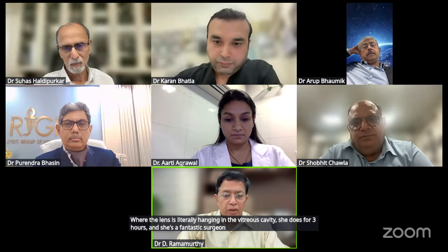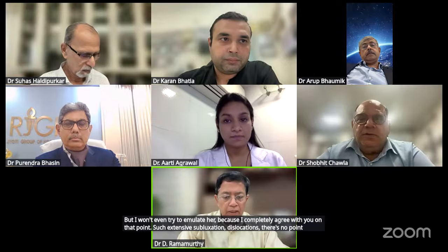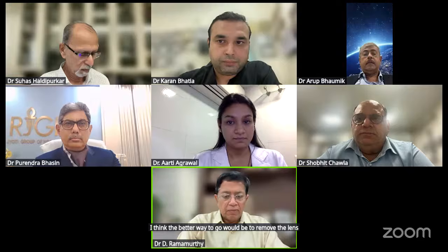Not many of us can emulate her, and I won't even try to emulate her because I completely agree with you on that point. With such extensive subluxation and dislocations, there's no point trying to prove anything. I think the better way to go would be to remove the lens and do a scleral fixation. So many excellent techniques are available today.